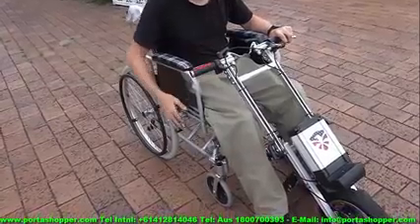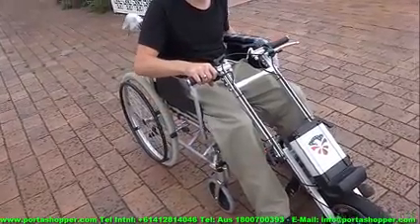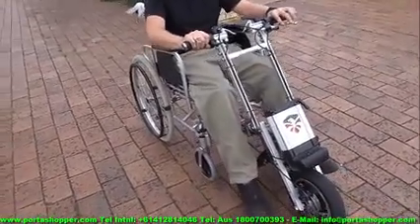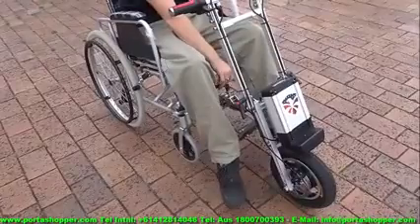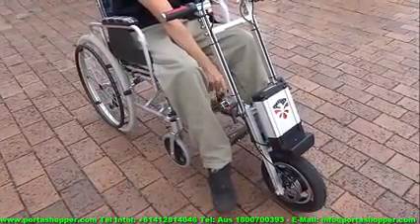So when you've engaged your wheelchair brakes, set your controls into reverse at the lowest speed and you'll hear the reverse beep sound come on. Then, whilst pushing the handlebar forwards, open the throttle gently so the drive unit can assist in lifting the wheelchair front casters and locking the hitch bar onto the tow bar. Don't be alarmed, as you will not fall over backwards.